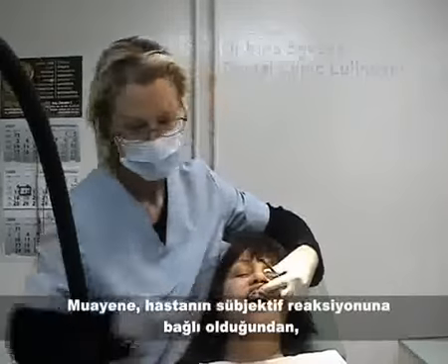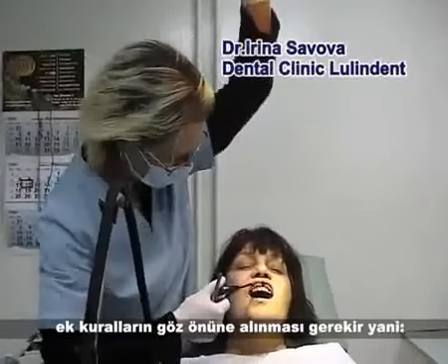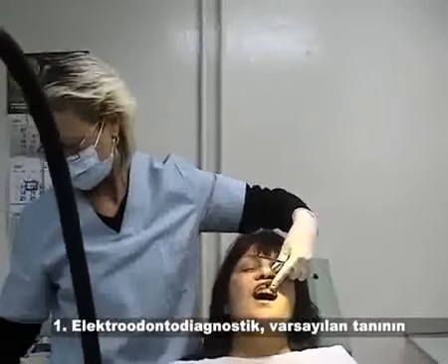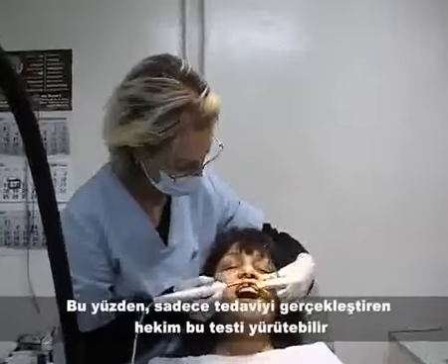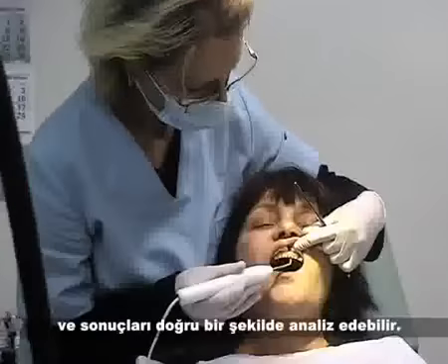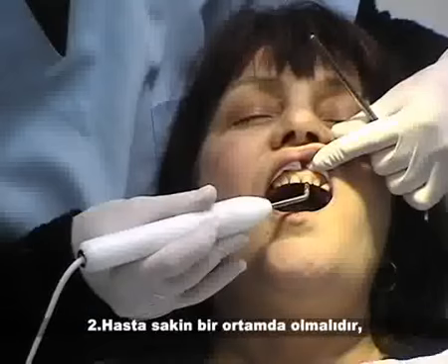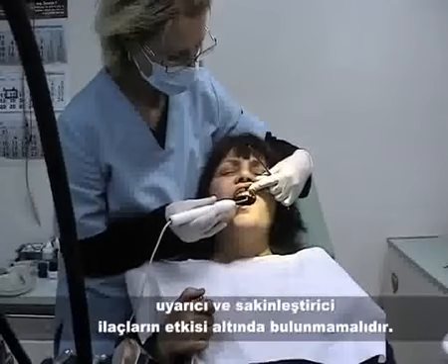As the examination is based on the subjective patient's reaction, the following rules must be taken into account. Electroodontodiagnostics serves to specify the previously supposed diagnosis. That is why only the dentist in charge of the treatment can implement the test rightly and analyze the result correctly. The patient must be in a calm atmosphere, free of stimulating and calming medicines.